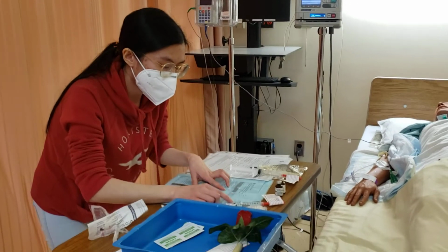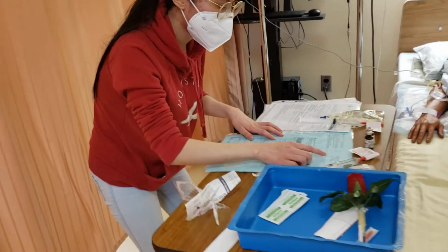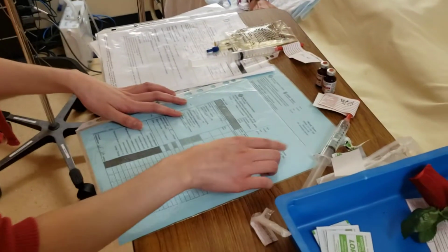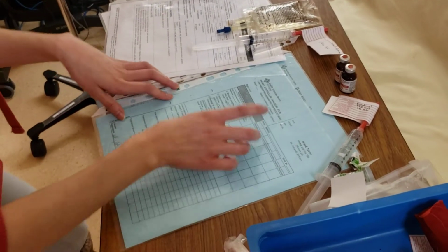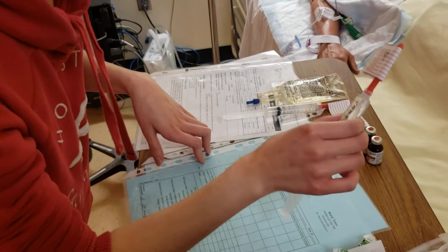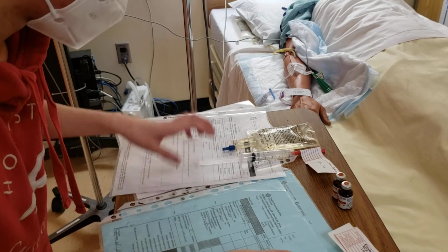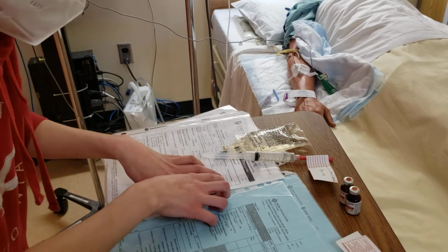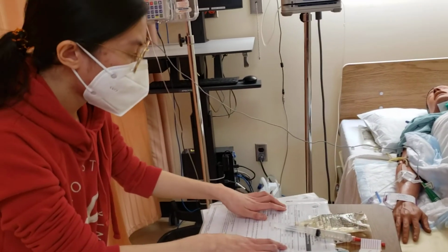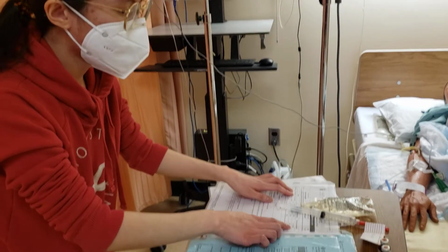I would need the MAR and the doctor's order. Ward Tyson, PIN number 123456789, 24 years old. Once again, it's ordered for fentanyl 10 micrograms per ml. To get that, I would need the concentrated 50 mcg per ml, or the 500 mcg, or the 2 of the 50 mcg per ml from this vial.